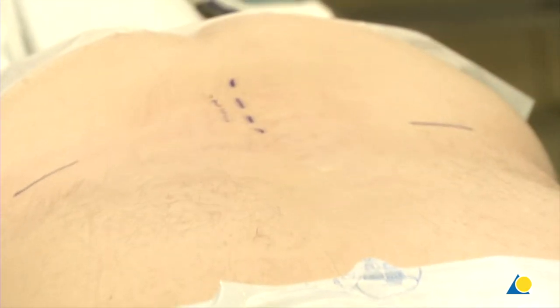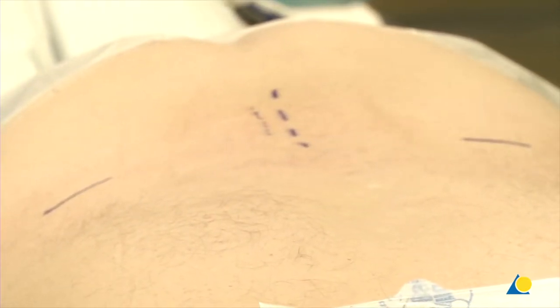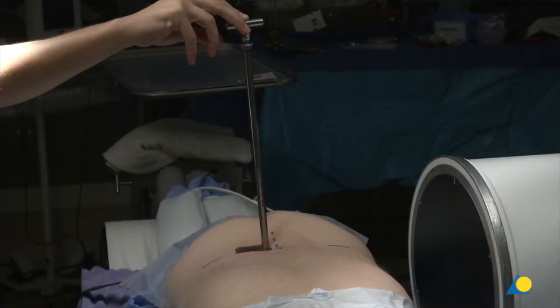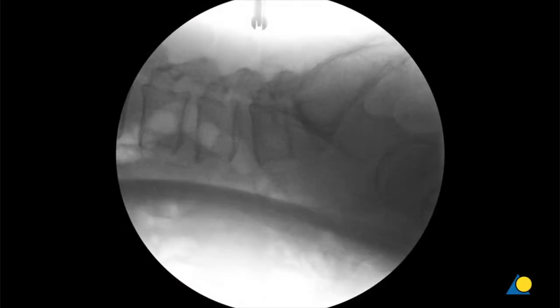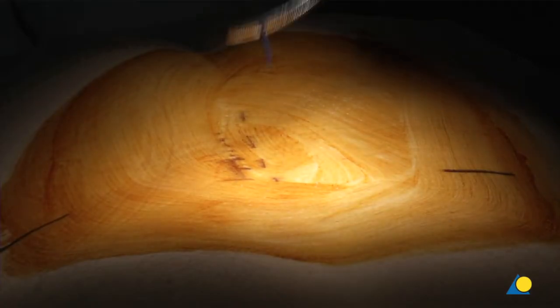We'll confirm the level with fluoroscopy before we actually mark the incision. We are just below the L4-5 facet joint. We're going to come down perpendicular, find the inferior margin of the L4 lamina, and dock our tubular retractor right here over the L4-5 facet joint but a little bit medial so we can see the lamina of L4. I'm going to mark this here now.